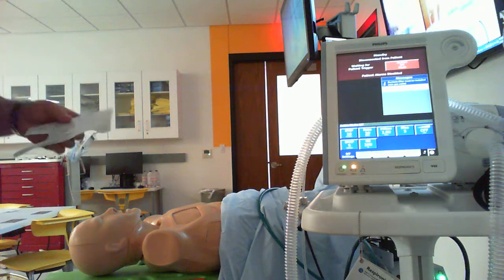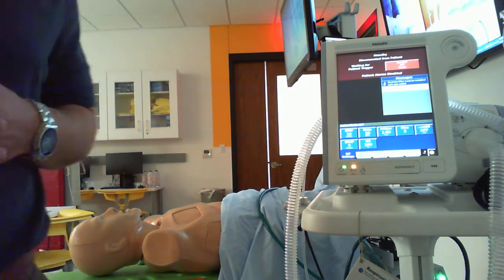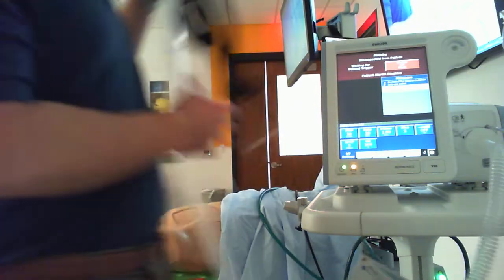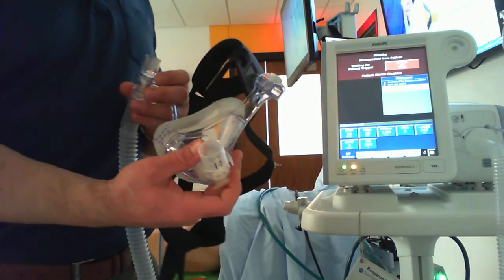If you choose too large of a mask, you're just going to have more problems with leaks, and you're going to end up having to tighten it down, making them more at risk for pressure injury. If you use too small, you're just not going to have a good fit. It's going to be uncomfortable. Their lips are going to be popping out, and all these different sorts of things. All right. So I've chosen my mask. All right, I've got everything all set up and ready to go.